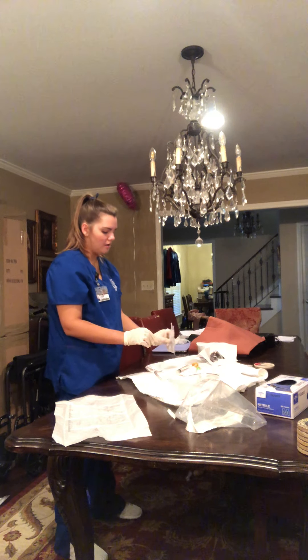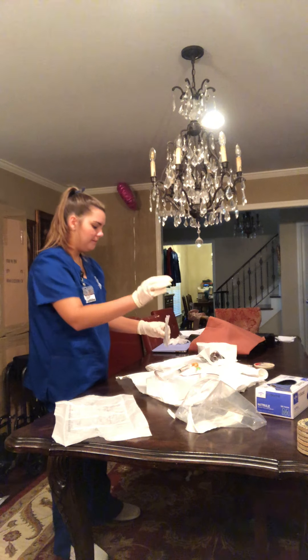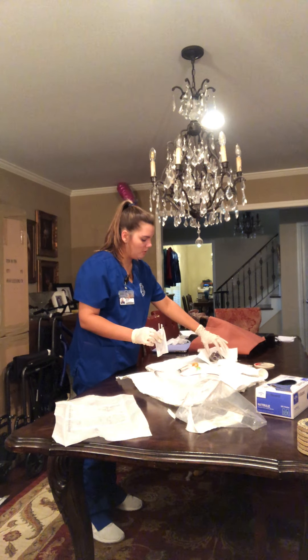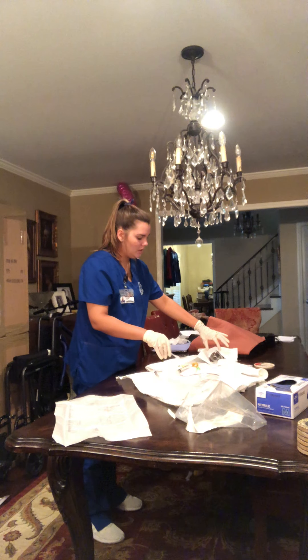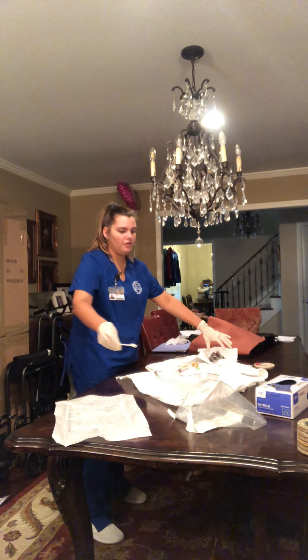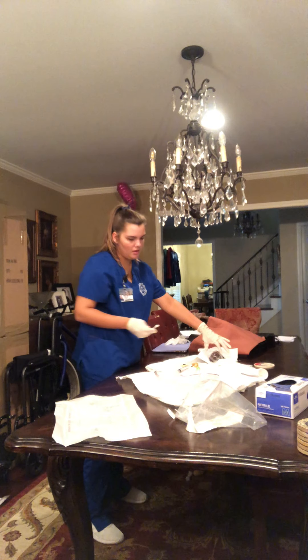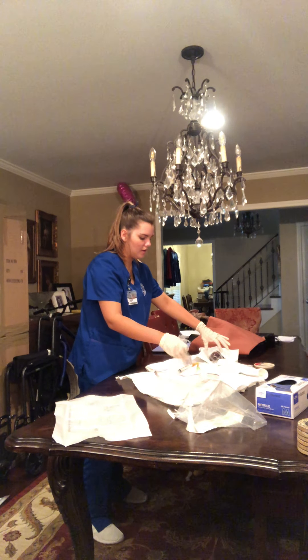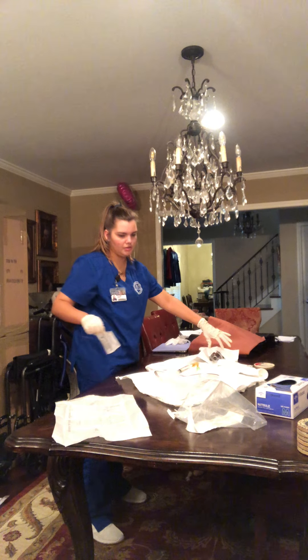Now I'm going to take my simulated swab sticks to be able to clean the area. I'm going to rip this, take it around, and drop just the top part. Now this is the part where I'm going to be contaminating my left hand — I'm going to place my left hand to hold up the labia. I'll take my swab stick and first go to the outer edge of the labia, wiping from top to bottom, then go around my sterile field and drop. Take my next swab stick, come to the closest labia, wipe from top to bottom, go around, and drop. Take my final swab stick and clean the meatus from top to bottom, go around the sterile field, and drop. Then take the wrapper around and drop as well.